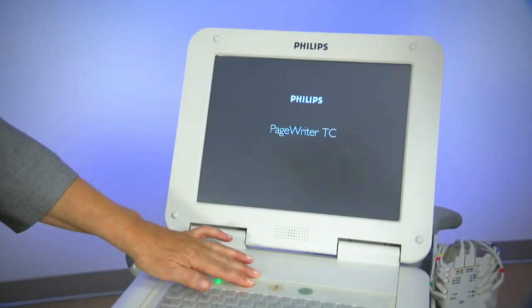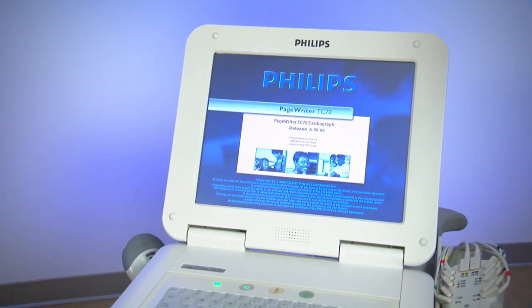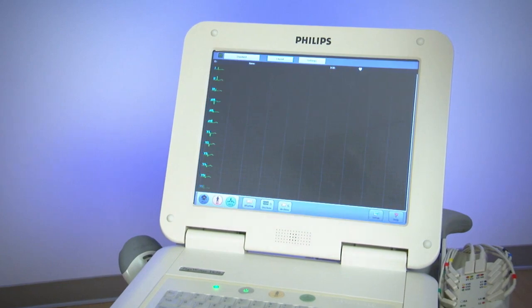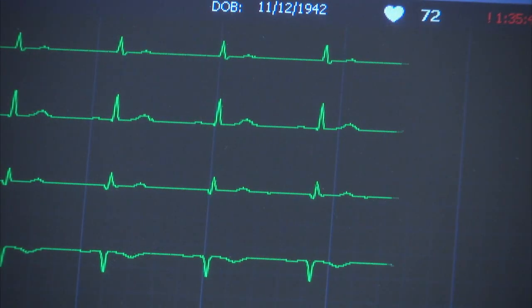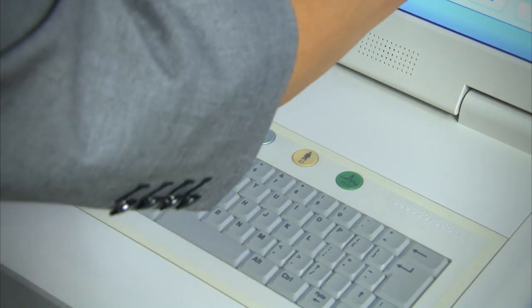The Philips PageWriter TC family of cardiographs all have the same easy-to-use software. All the cardiographs support the latest Philips DXL algorithm with diagnostic reports that follow newly updated guidance and recommendations from the medical community. The cardiographs are touchscreen or hardkey.